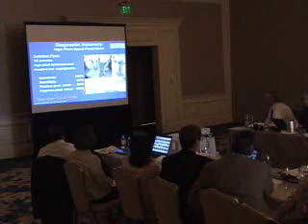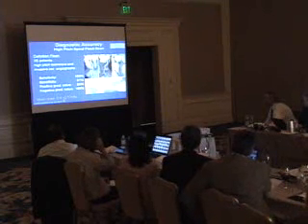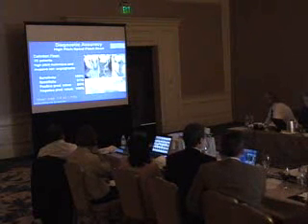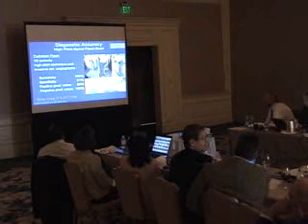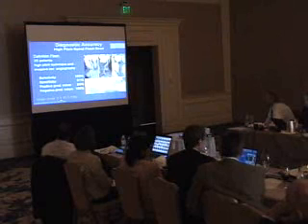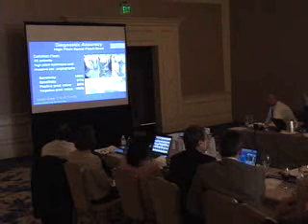And with this approach, it's been reported by Leszka et al. in the European Journal of Radiology, 35 patients, small study, brand new equipment. And we see a beautiful demonstration of the coronary arteries with a mean radiation dose of 0.9 millisieverts, getting down to 1/3 of the background radiation levels.